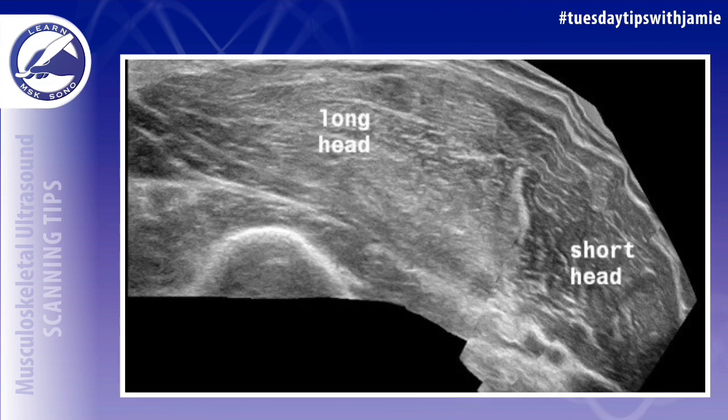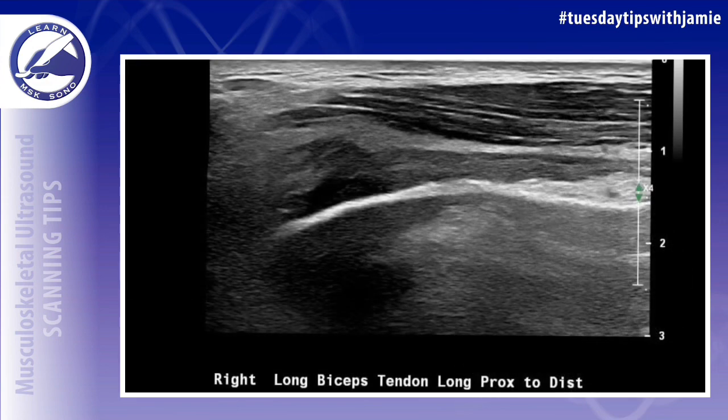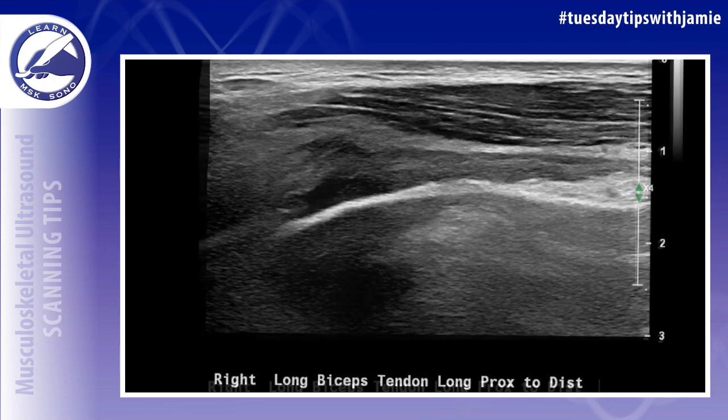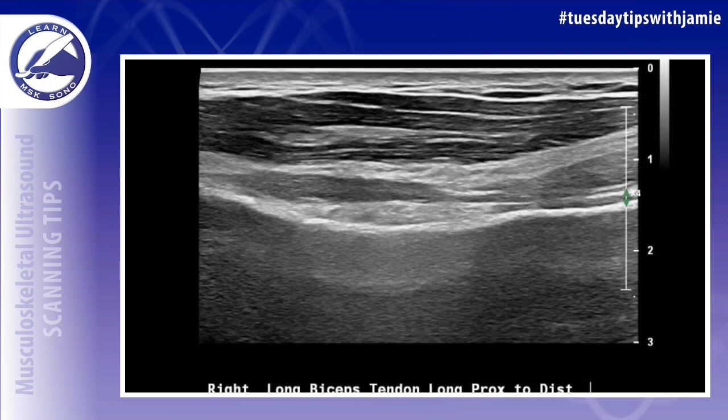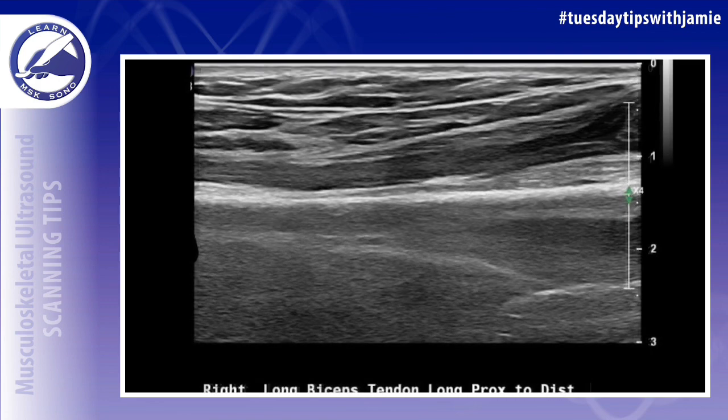In this case you can see that the long head biceps muscle is also atrophied compared to the short head. You must remember to thoroughly evaluate this space. The bicipital groove will appear hypoechoic and edematous when a rupture is present. There will be a loss of the normal tendon echo texture and the tendon sheath will be filled with simple or complex fluid.